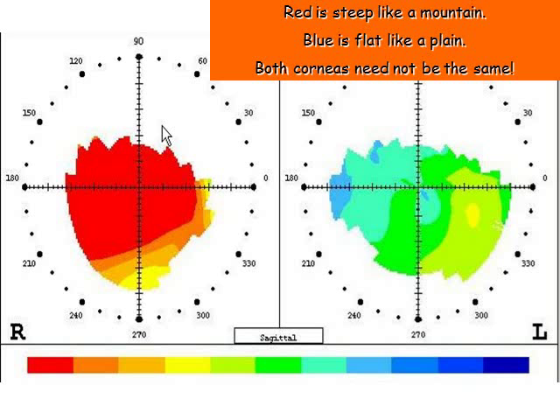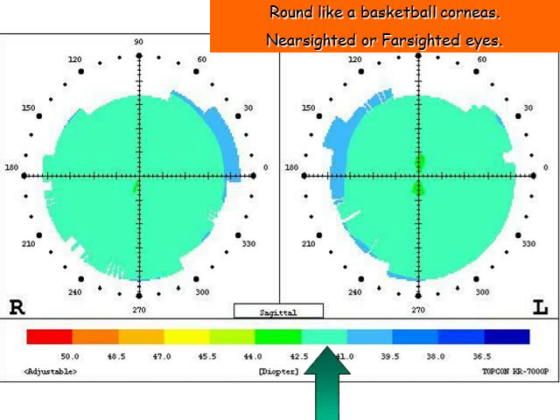These are the front curves of your cornea, the front clear window that lets the light into your eye. It is the most powerful optical surface, so you would like to know if it is normal and stable. It is like a topographical map — red is steep like a mountain, blue is flat like a plain. These images are light green in the middle with normal curves, fairly uniform, indicating a round eye shaped like a basketball, meaning the eye is just slightly nearsighted or farsighted with very little or no astigmatism.